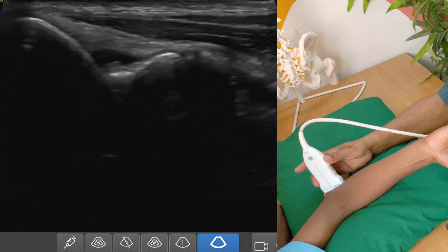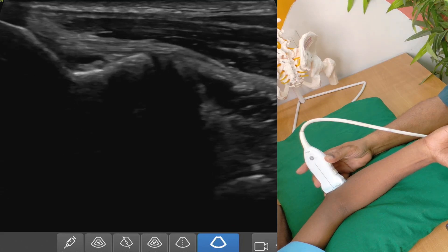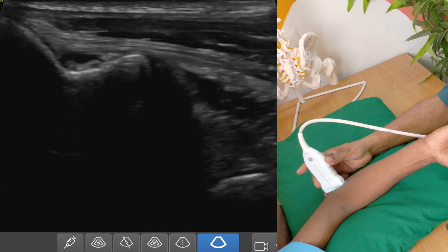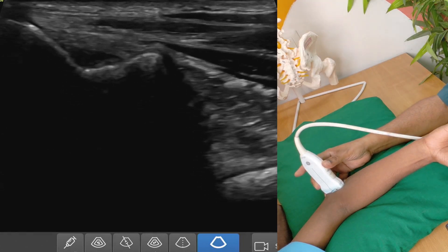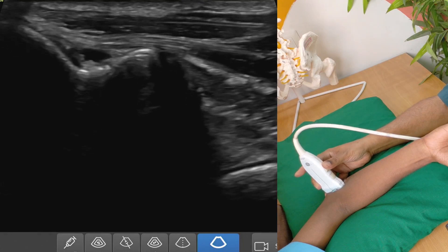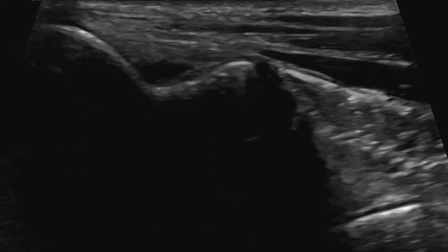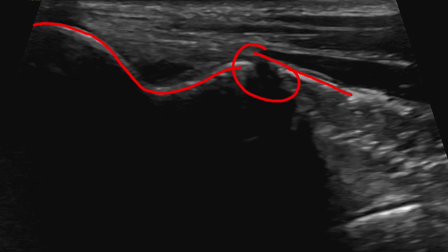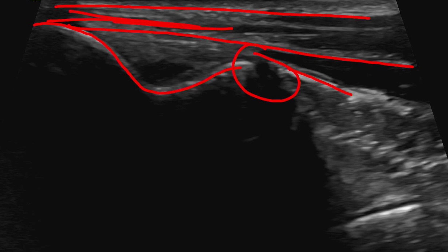I am holding the probe like this. For the common flexor tendon, our probe should be facing towards the thumb. Here, this is the medial epicondyle. This is the sublime tubercle of the ulna. And this is the joint. This part is the common flexor tendon up to here. The lower part is your medial collateral ligament, or medial ligamentous complex. This is the anterior band of the medial ligamentous complex.